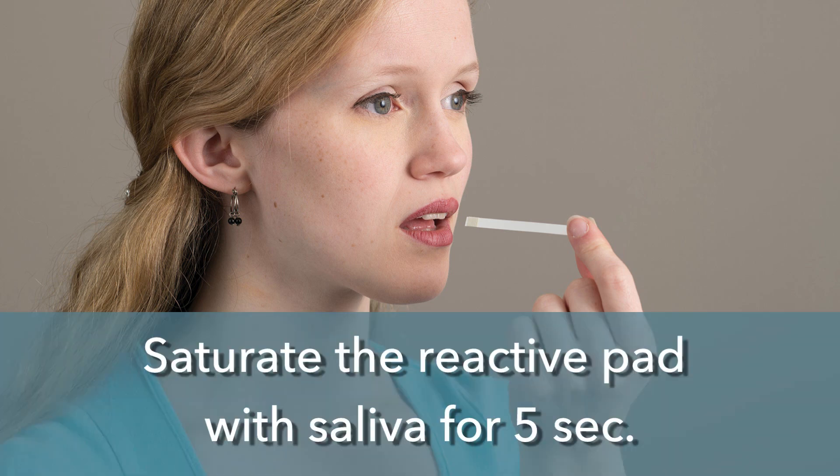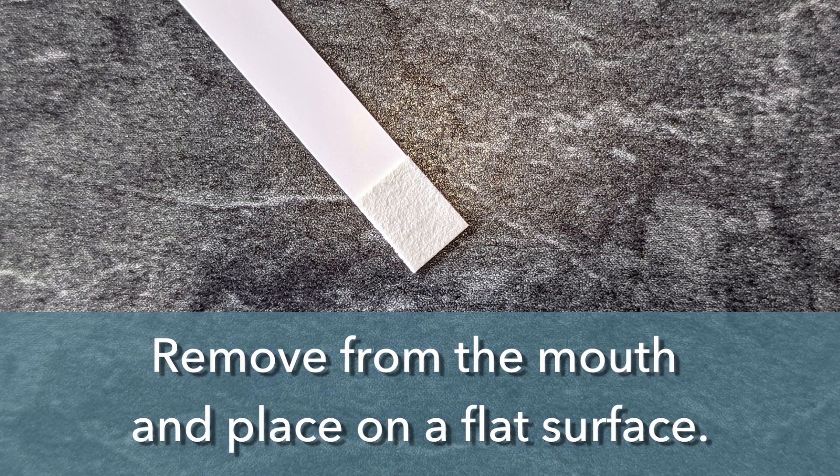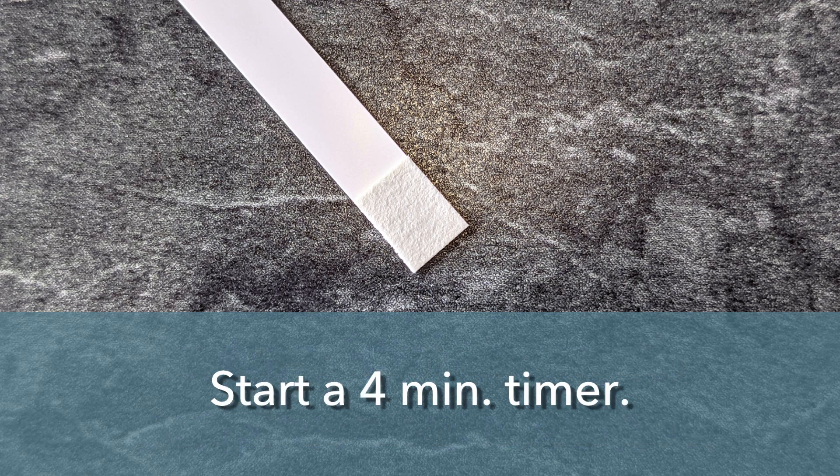Hand the test strip to the donor and instruct the donor to saturate the reactive pad on the test strip with their saliva for 5 seconds. After 5 seconds, have the donor remove the saturated test strip from their mouth and place it on a flat surface. Start a 4-minute timer.